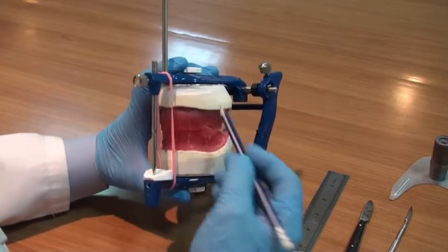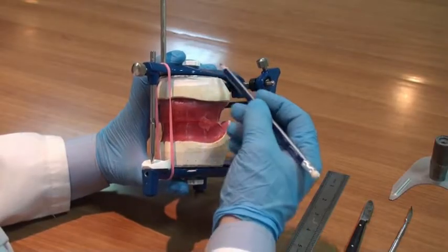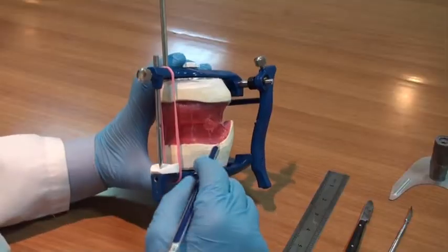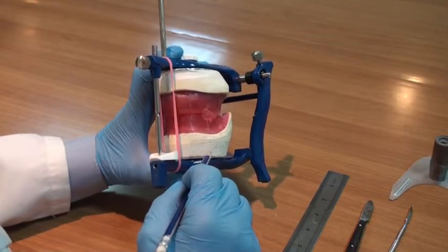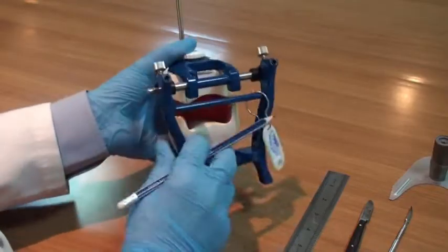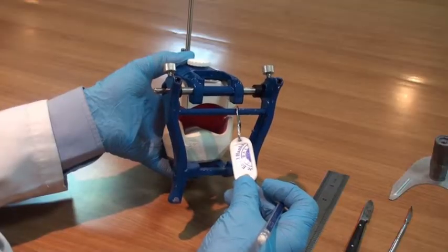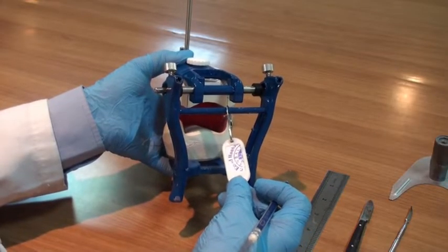Now, the plaster mount should be trimmed neatly. Wash all the plaster off the articulator and never present a dirty articulator or a rough, untidy mounting. A color-coded tag with the name and registration number must be attached securely to your articulator.